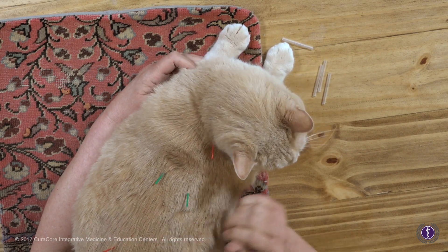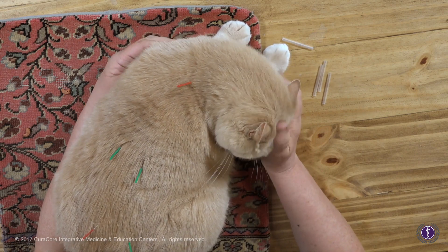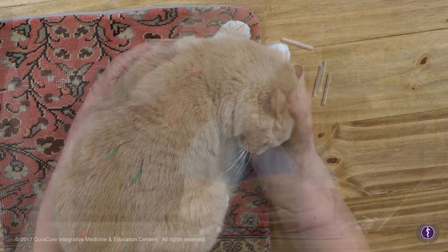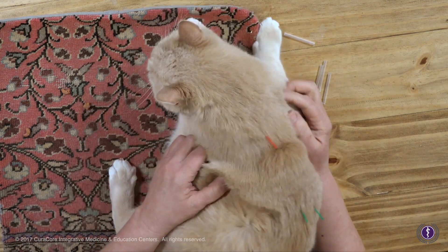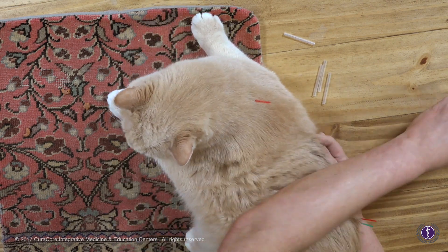Just inserting to the depth available. This seems like about the number of needles he's interested in for today, and once we're done with those we can take them out.